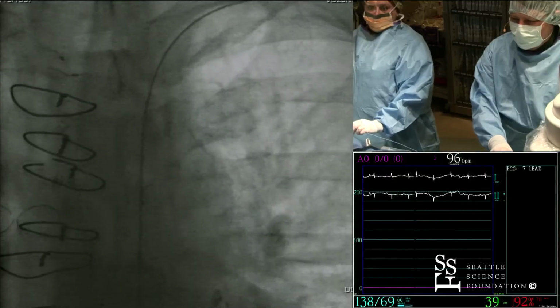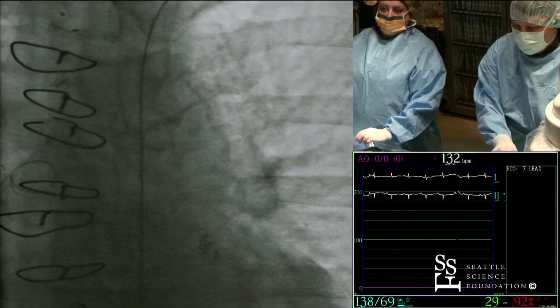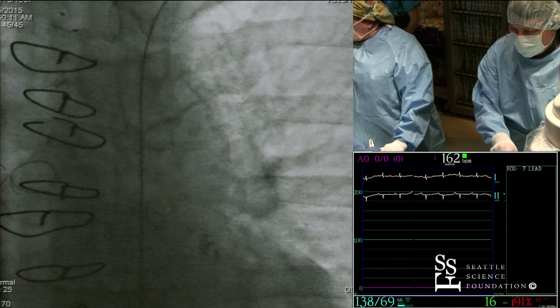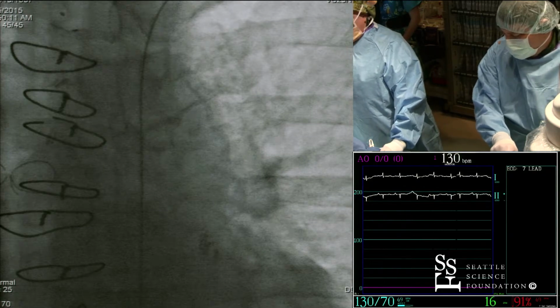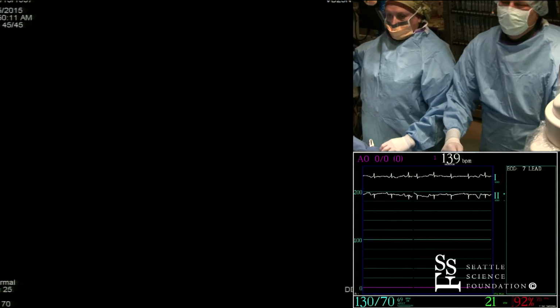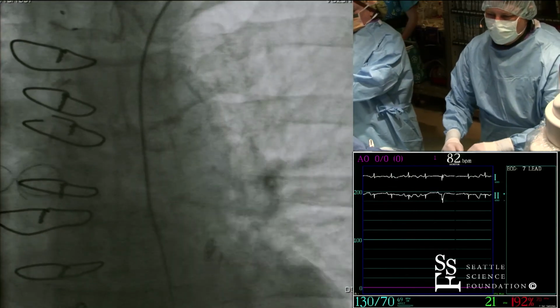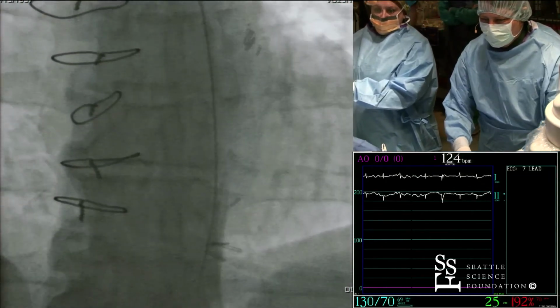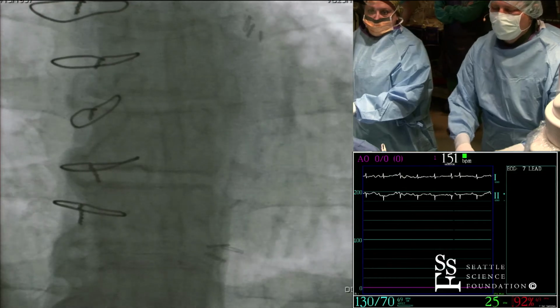There we go. See, now you can see there's the wire, and it's probably down in the descending there. So one of the things that we've learned is to stop fluoroing when we're advancing the catheters once the wire's in, and that cuts down on the radiation a bit. And so you can kind of get a sense about where you are. Obviously, in this case, we are likely down the descending aorta, as you can see here. So we're going to pull back.